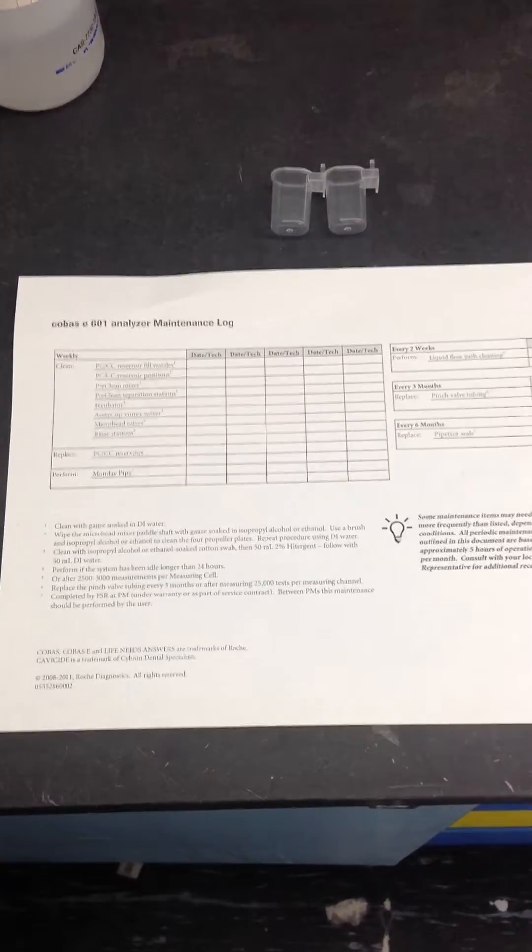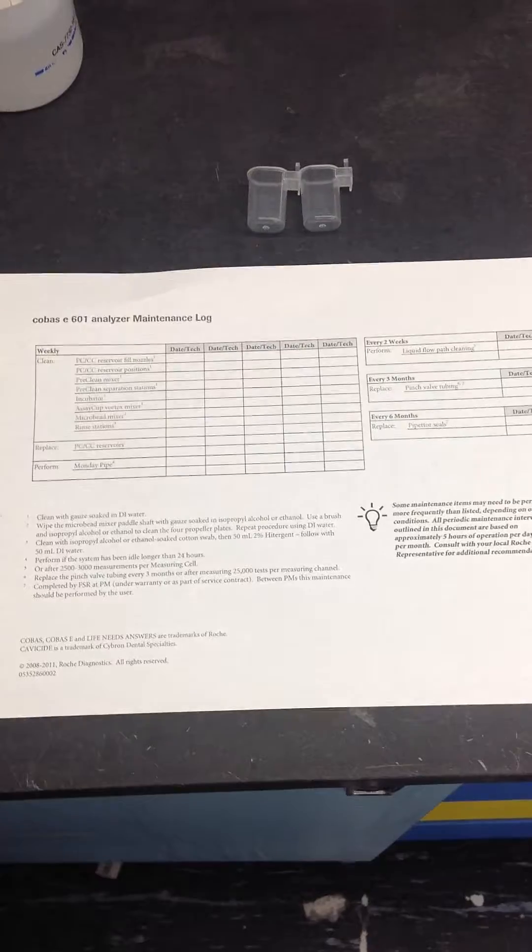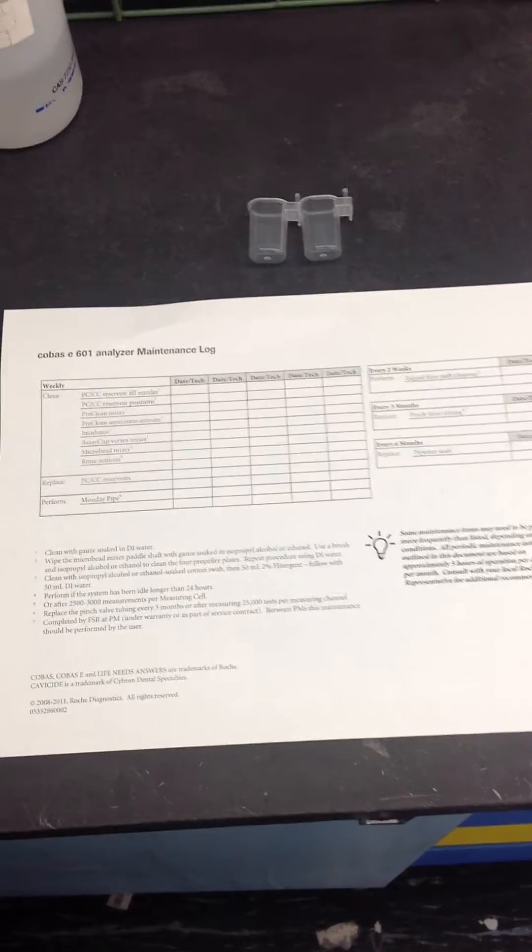Alright, so I'm going to do a quick overview of the weekly maintenance on the Kobus 6000.